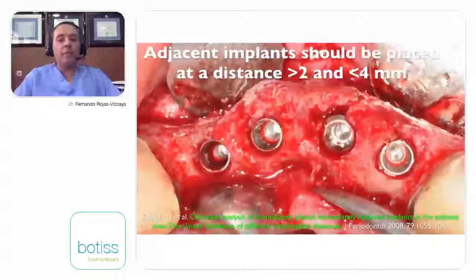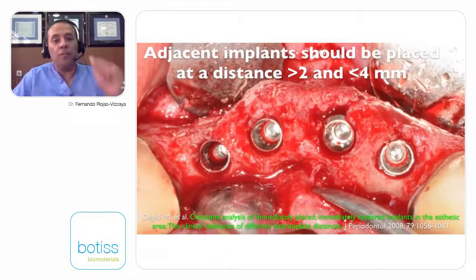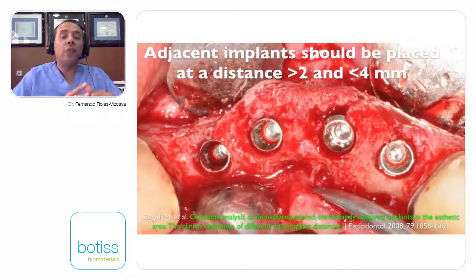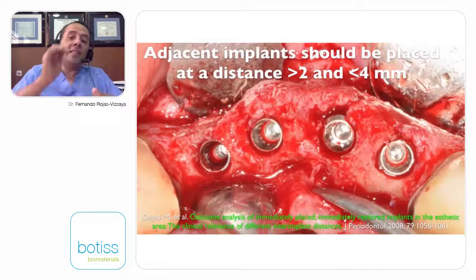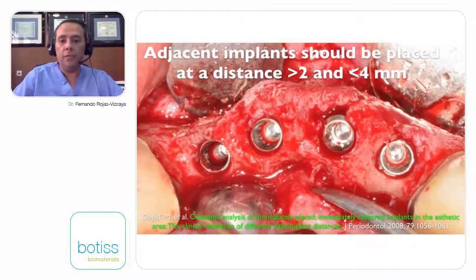So now I can place the implant, and if I am good enough placing the implant, I can control the angulation. With this implant, we have the 3A: the implant is 3 millimeters from the margin of my new crown. We have the 2B, and I have the correct angulation, with the implant axis behind the incisal edge. We will see at the end. So during the drilling process, we control.